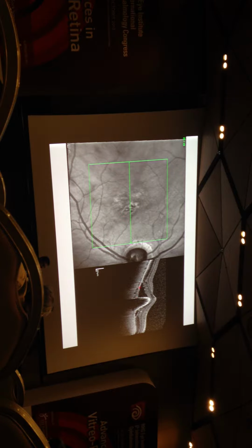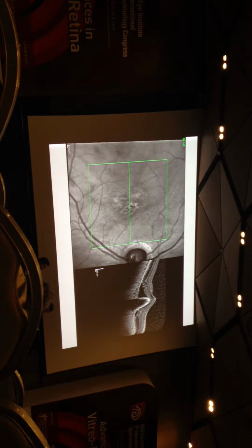Here you have masking, and this is why the fluorescein was not showing a very high leakage from the ring. I have some cases where you have a kind of reaction of fibrosis, and the RPE is growing over and starts to be in autofluorescence again, because of the reattachment of the photoreceptors and the reproduction of lipofuscin, which is quite amazing.